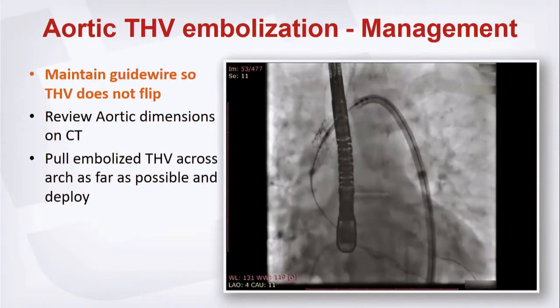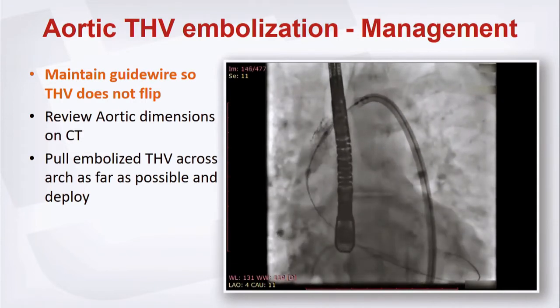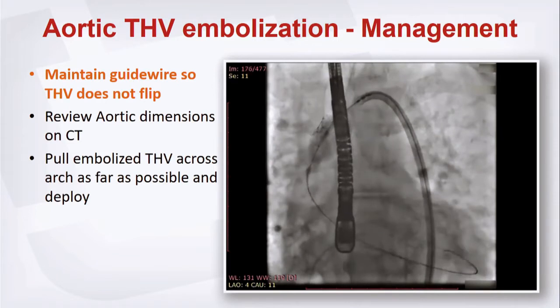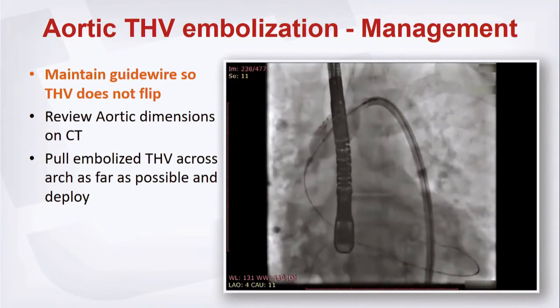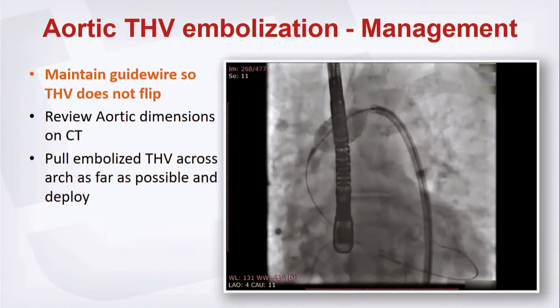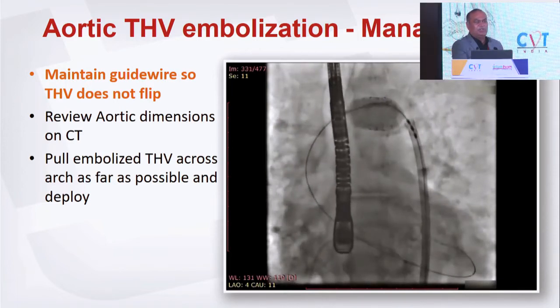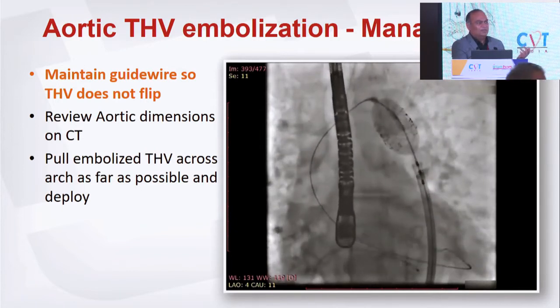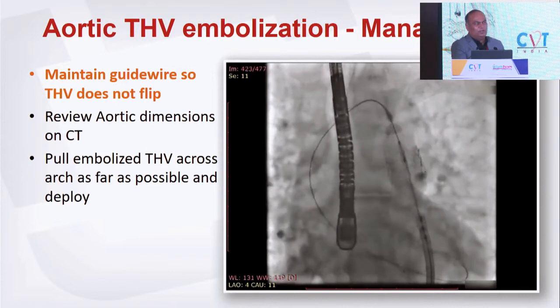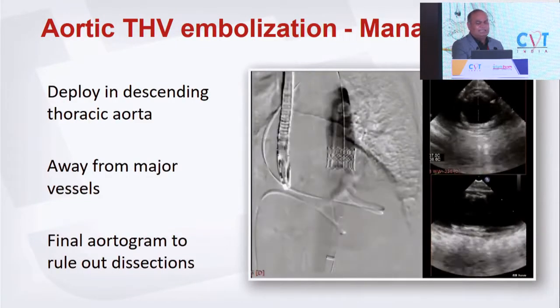Don't let the wire come back. Keep the wire in position. Most times, the Sapien, you can drag it to the descending aorta. So open your CT, or ask someone to open your CT, check the measurements of your aorta. Like, what is the size? How low can you bring it? Can you bring it infrarenal, or do you have to deploy in the thoracic aorta? Inflate the balloon ahead of the Sapien. Drag it all the way down in the descending, and then deploy it in the descending.